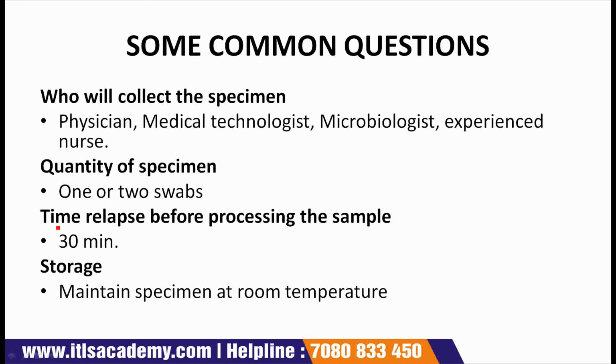Next question is: time lapse before processing the sample, and the answer is 30 minutes. Storage: maintain specimen at room temperature. This specimen does not require any specific temperature or refrigeration or freezing.